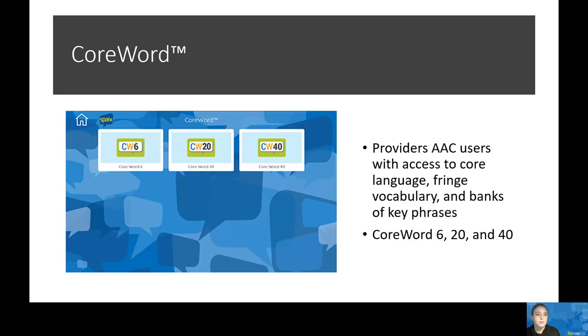Next, I want to talk about the core word language system. This provides AAC users with a powerful combination of core language, fringe vocabulary, as well as banks of key phrases. There are three levels: Core 6, 20, and 40. These correspond with vocabulary layouts and content derived from studies of individuals with AAC across the lifespan. This core word language system features dynamic vocabulary layouts that automatically change as the user makes selections — once a word has been selected, the layout updates to show words that are likely to be used next. This ensures maximum efficiency with a minimal learning curve.